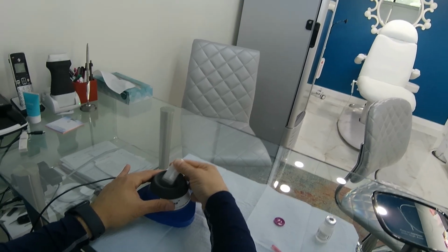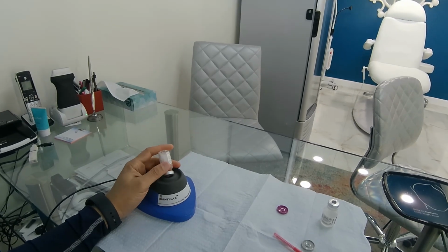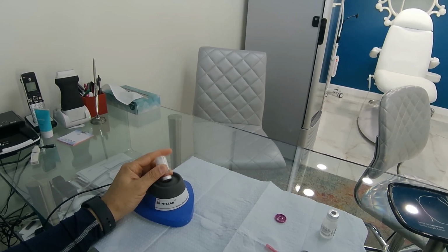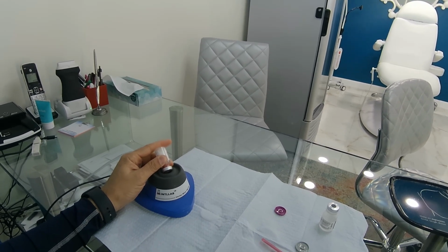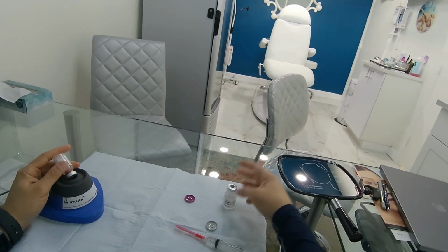If you don't have sterile water, you're asking, oh, can I use saline? Yes and no. Yes, if you have to, but no if you don't have to, because the studies show it's still effective when you use saline, but the Sculptra particles dissolve better and work better when they're in a sterile water environment. So number 1 option would be sterile water, and number 2, if you have to, then you can use saline.